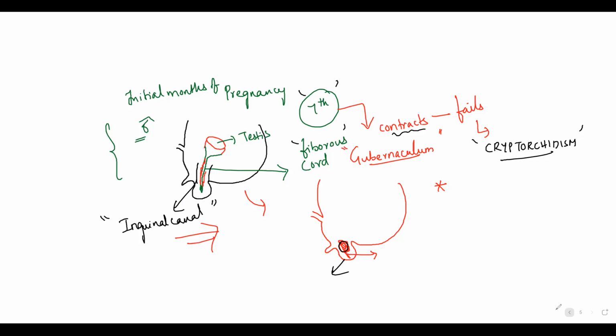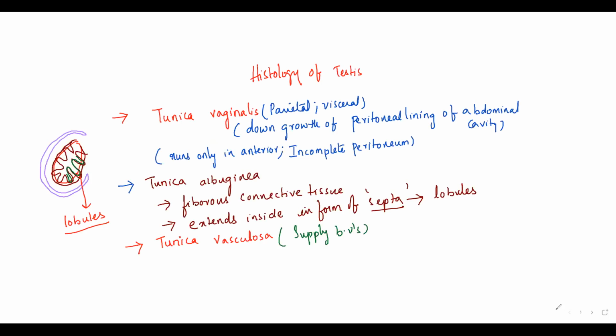I hope, children, you all have understood the histology of the testis. I hope you have even got a clear idea by looking at the slides that I needed to show you all.